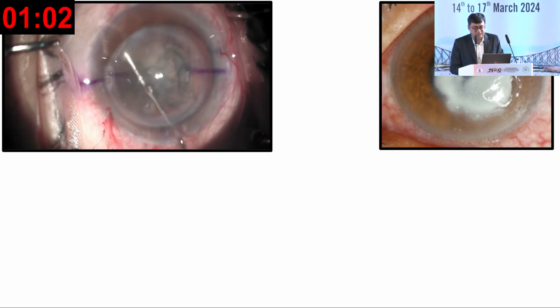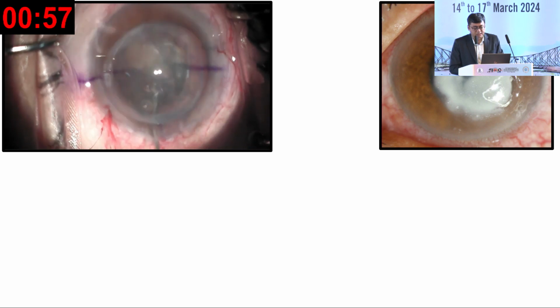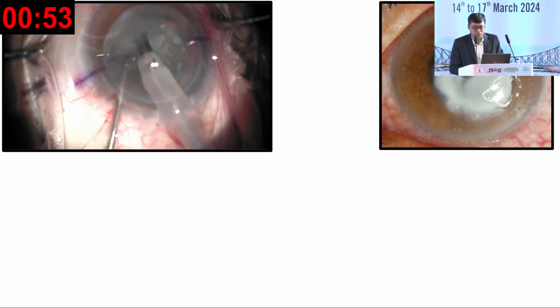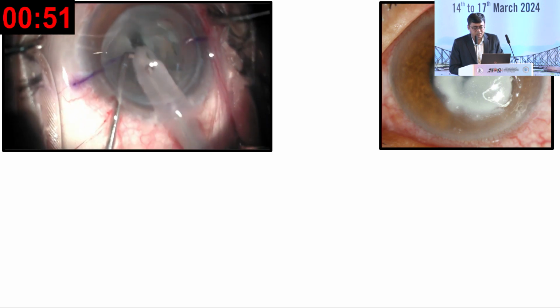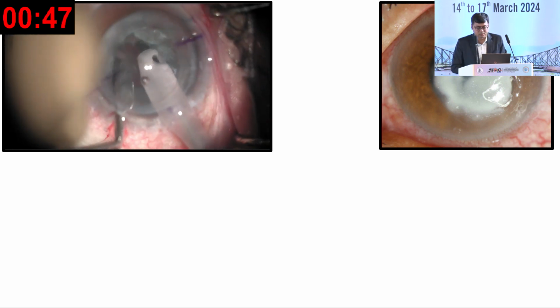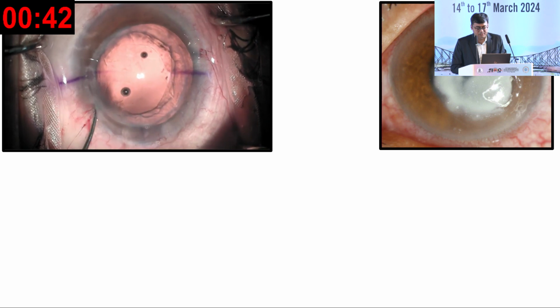and basically the surgery has to be done quite slowly compared to the normal speed at which you may operate for your other cases. Each step has to be slow and deliberate. I generally don't perform a direct chop in these cases. I do a stop and chop. So now the nucleus management has been done.